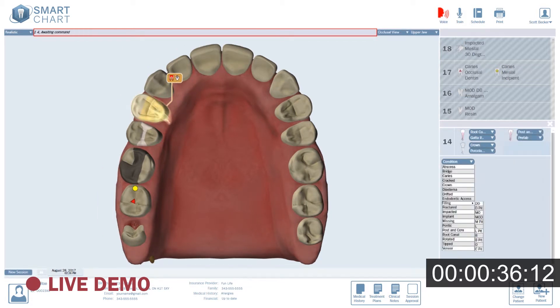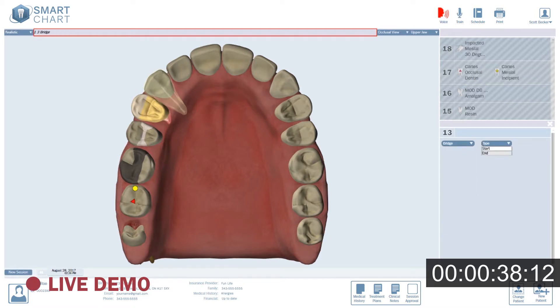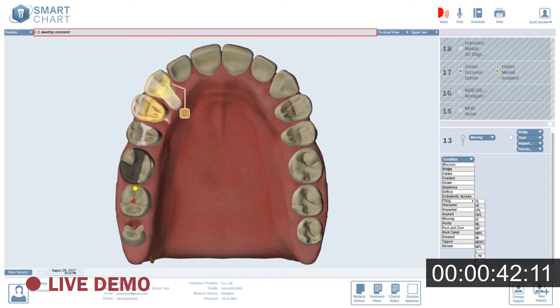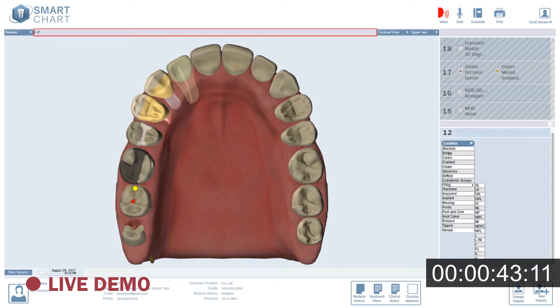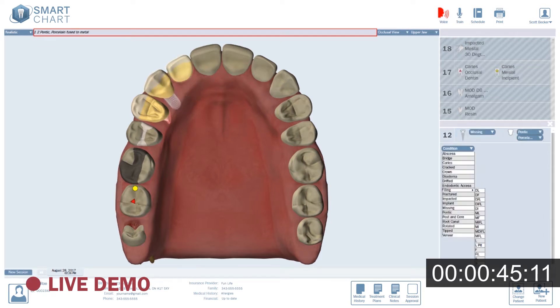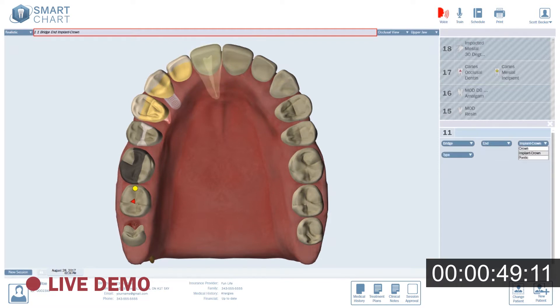1.3: Bridge start, implant crown, PFM. 1.2: Pontic, PFM. 1.1: Bridge end, implant crown, PFM.